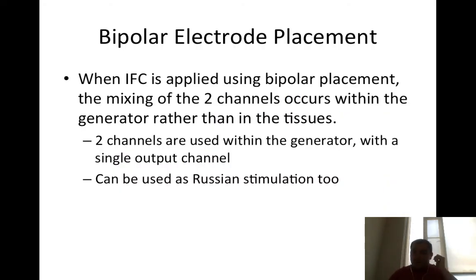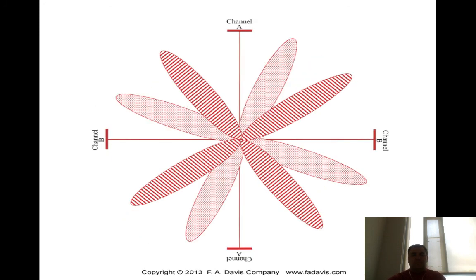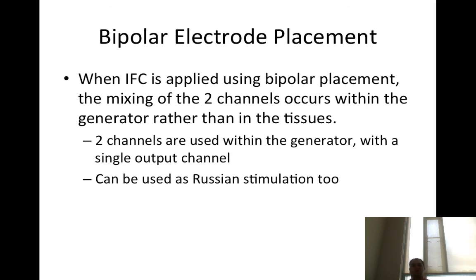Bipolar pads. When IFC is applied using bipolar placement, the mixing of the two channels occurs within the generator rather than the tissues. Not that worried about that. So let's back up here.